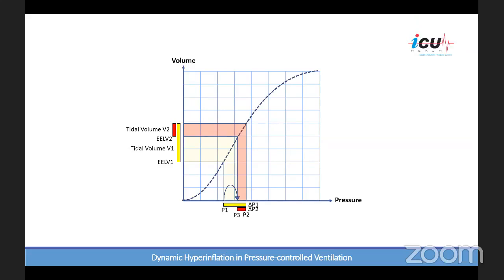That's great, thank you. There's a long question here. Asthma with flow obstruction causes Auto-PEEP in a different way compared to emphysema with flow limitation. Do you suggest a different way of dealing with the Auto-PEEP given the different pathophysiology?